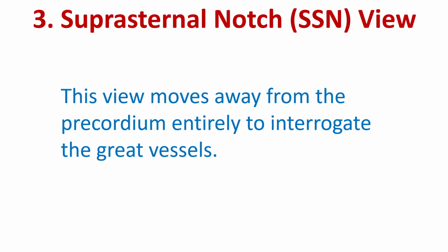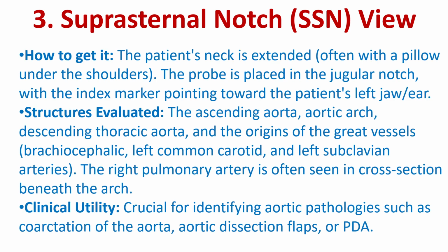Suprasternal notch view. This view moves away from the precordium entirely to interrogate the great vessels. The patient's neck is extended, often with a pillow under the shoulders. The probe is placed in the jugular notch with the index marker pointing towards the patient's left jaw or ear.